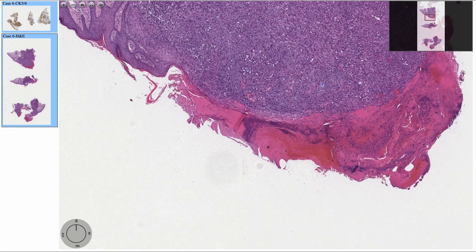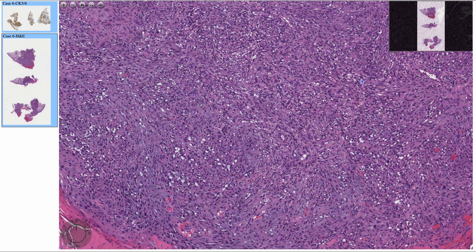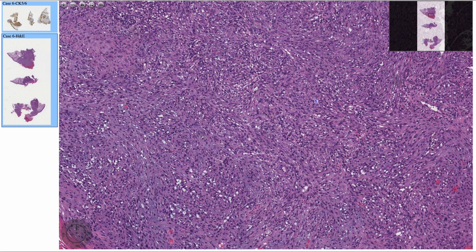And you'll have these fascicles of pleomorphic spindle cells. If you see the spindle cells in the epidermis and dermis, you want to have your differential of SLAM. S for spindle cell squamous cell carcinoma, L for leiomyosarcoma, A for atypical fibrosanthoma — a diagnosis of exclusion — as well as angiosarcoma. And M for melanoma.